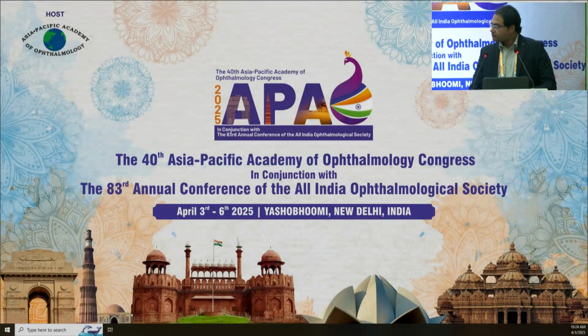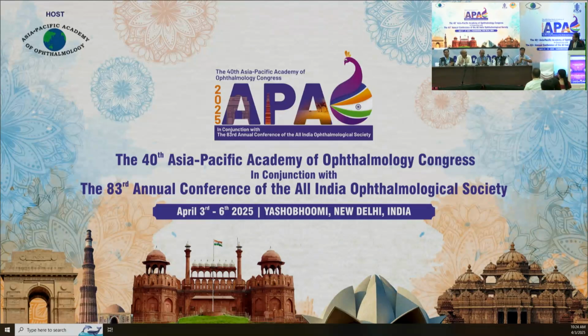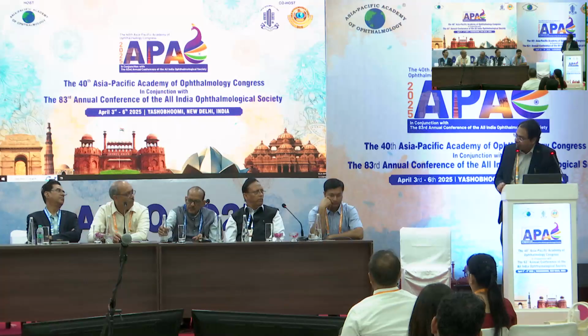Very nice. I think one question. One advantage of OCTA over OCT or angiography. So yes, I always say OCTA cannot replace FFA. Both the modalities are at their own places. But yes, OCTA has the advantage of being non-invasive. So if a patient with hypertension or kidney disease comes to you, you do not need to inject any dye. You just go straight away for an OCTA and you'll get the entire image, and your treatment can go ahead. However, FFA carries a huge risk of having a reaction, maybe an anaphylactic reaction.